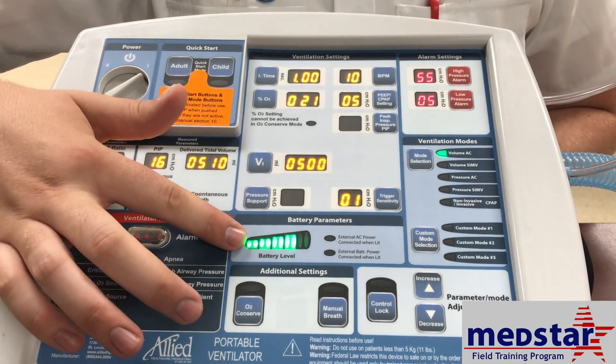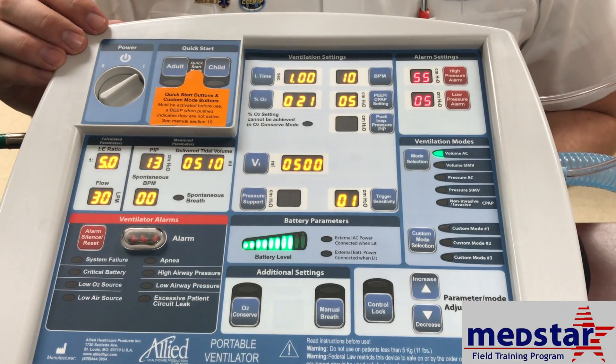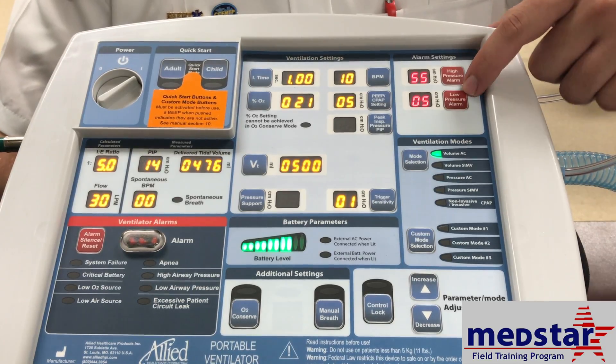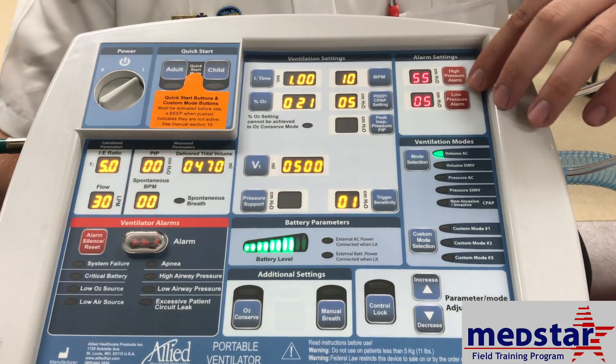There is a battery level indicator to tell you how much battery you have left. You also have your pressure settings for your pressure alarms up here, which you can adjust. Once again, speak with your respiratory therapist to find out what their alarm settings are and then adjust accordingly.